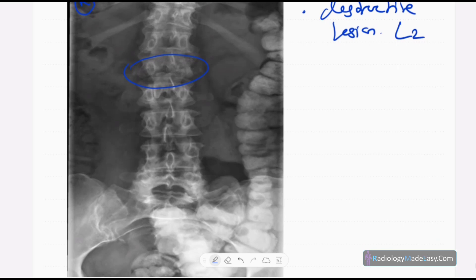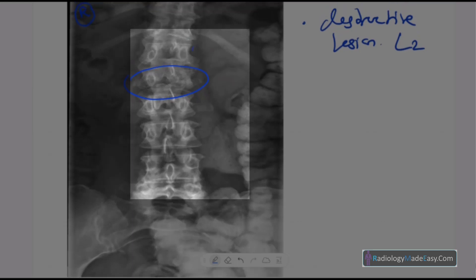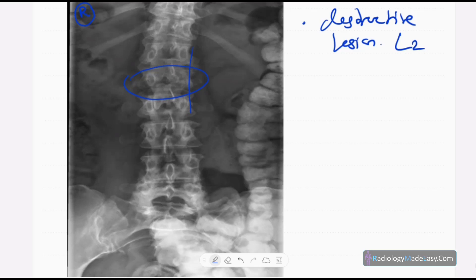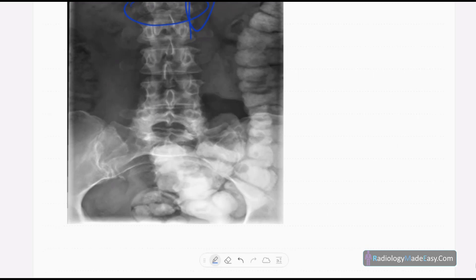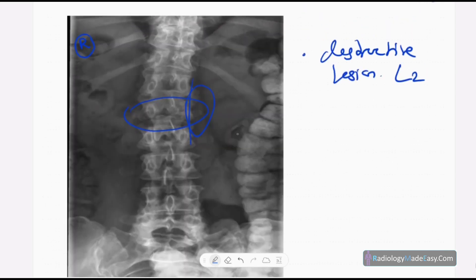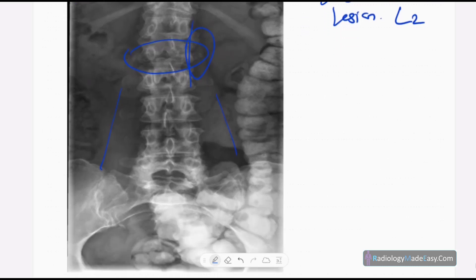There is also mild scoliosis with concavity to the left side. The other vertebrae appear normal and the vertebral spaces are also normal. Spinous processes are intact and there is no obvious soft tissue component in this region. The right pedicle is intact, SI joints are normal, and psoas shadow is seen clearly. Overall there is a destructive or lytic lesion in the L2 pedicle.